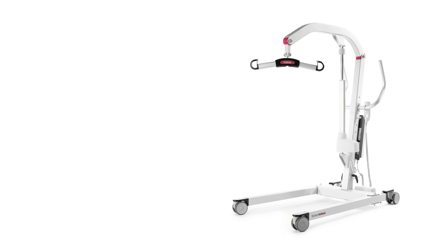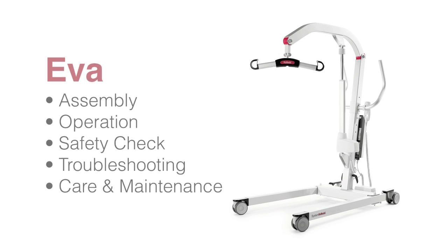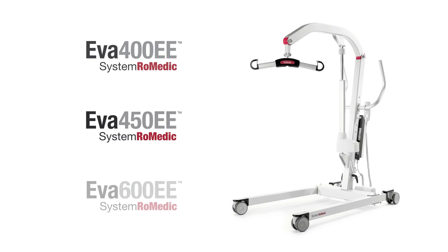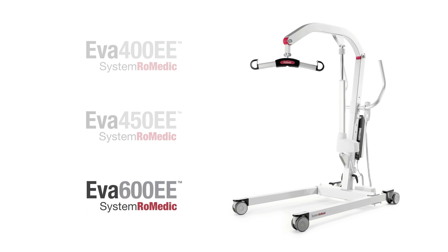In this video, we will discuss the operation of the Eva lift, including assembly, operation, safety checks, troubleshooting, as well as care and maintenance. Systemromedic includes 3 models with a weight capacity of 400, 450, and 600 pounds. The Eva lift is available with electric boom and electric leg widening. In this video, we will primarily discuss the Eva 600 EE, and we will demonstrate the various slings and accessories, including the ambulation arm for gait training.